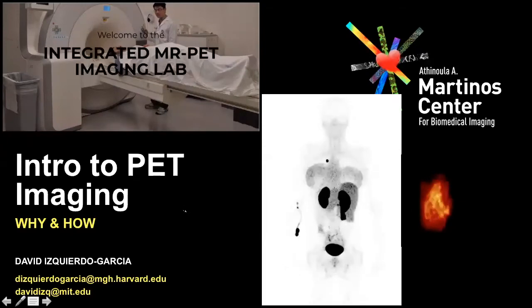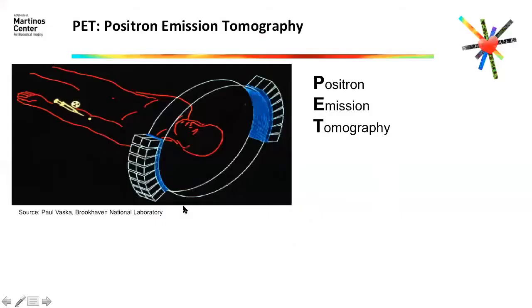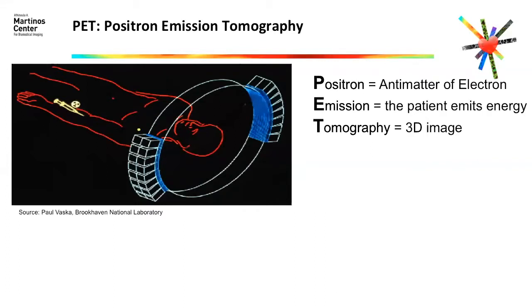So let's start. What is positron emission tomography? PET stands for positron emission tomography, which is basically a tomography, a 3D image of how the patient functions.